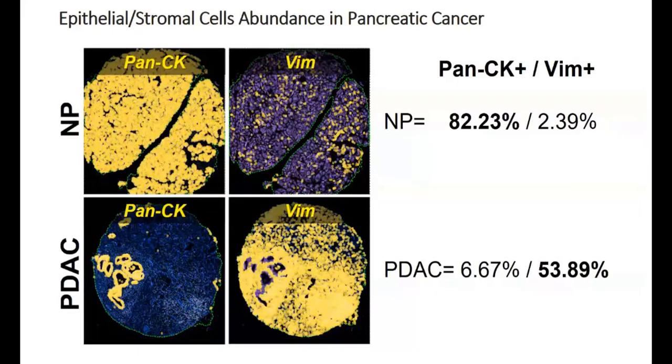Well, the first thing that we did is to check the expression of pancytokeratins and vimentin, but from the perspective of the singular identities. And here we can immediately verify the accuracy of this pipeline. Since pancreatic cancer is well known to have a very strong difference in the amount of fibroblastic cells versus epithelial cells, and as you can see here, practically the ratio is totally inverted.